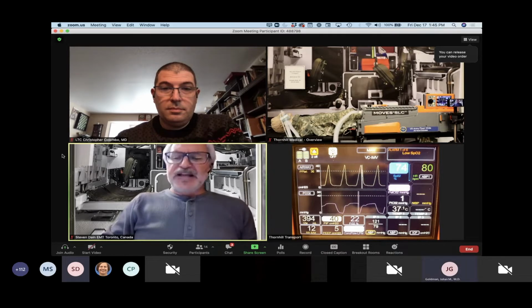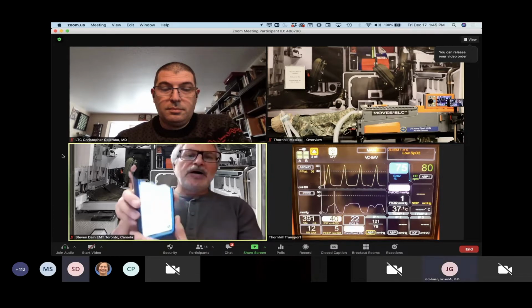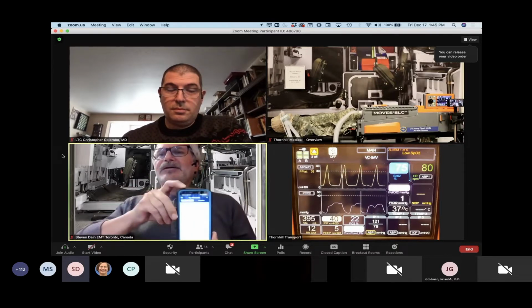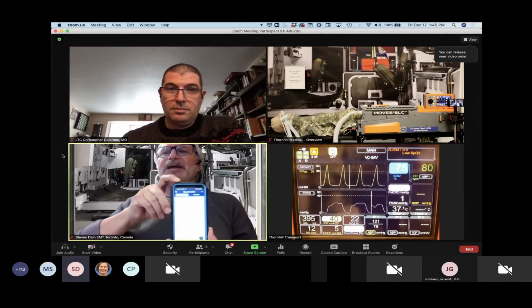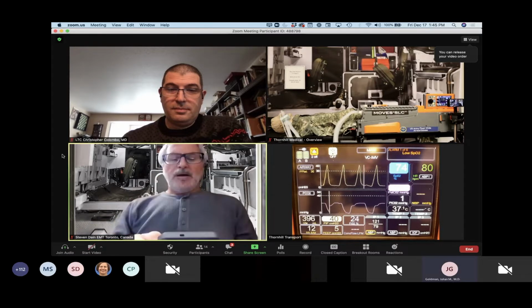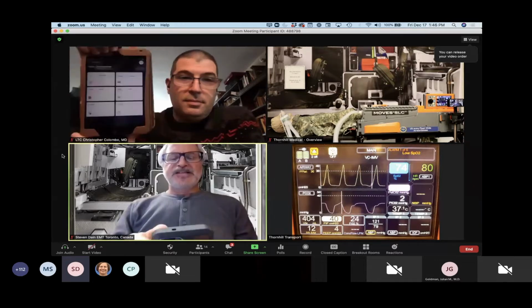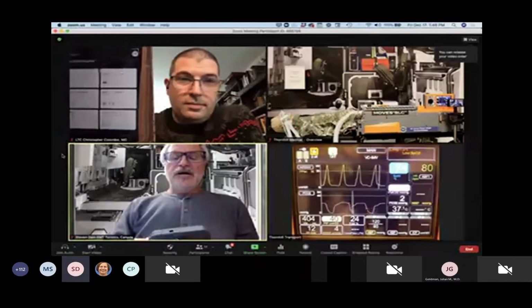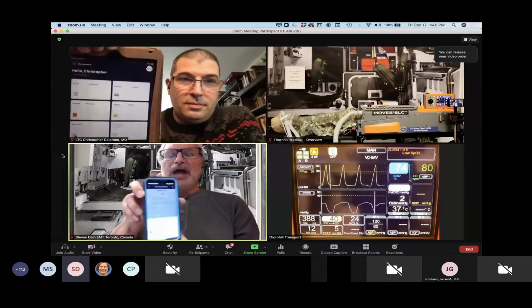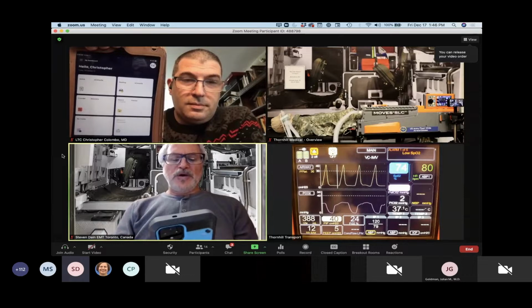I'm going to use the Netson Omnicure telemedicine virtual critical care application to call for help. And you can see the application somewhat on my screen there. I'm now going to call for help. I see that Dr. Colombo is available on my application. I'm going to call him right now.